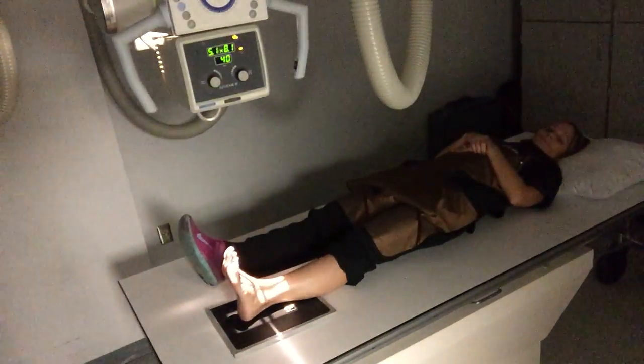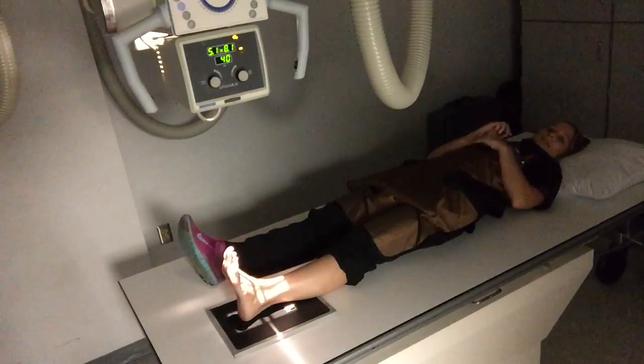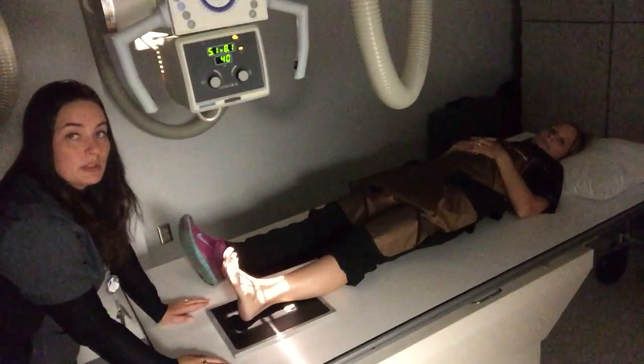And then I'm going to expose this at 70 kVp. All right, so that's AP. Then we're going to do an oblique projection.